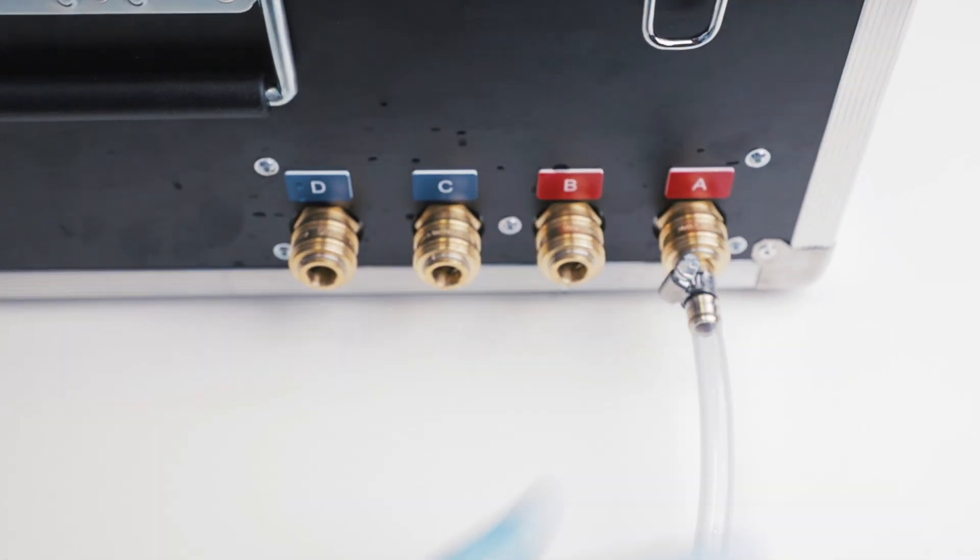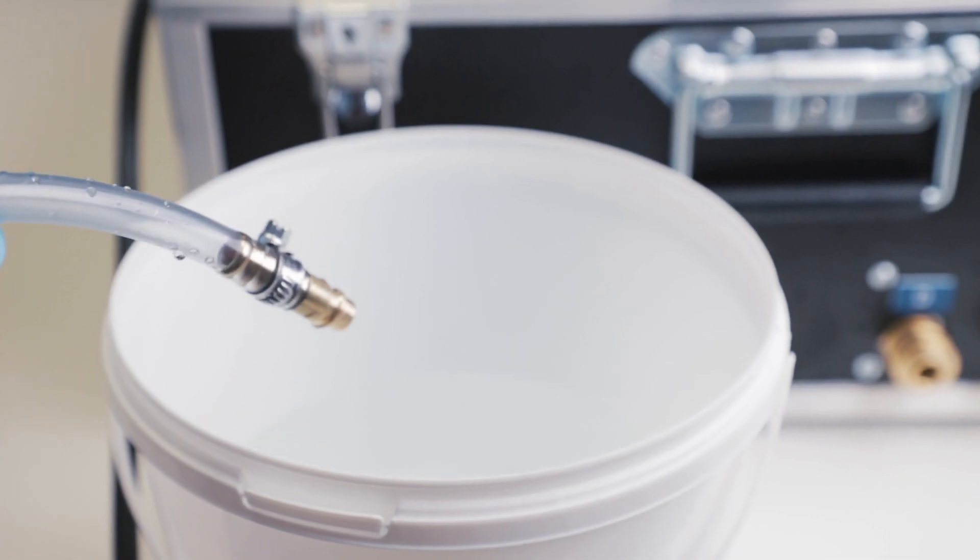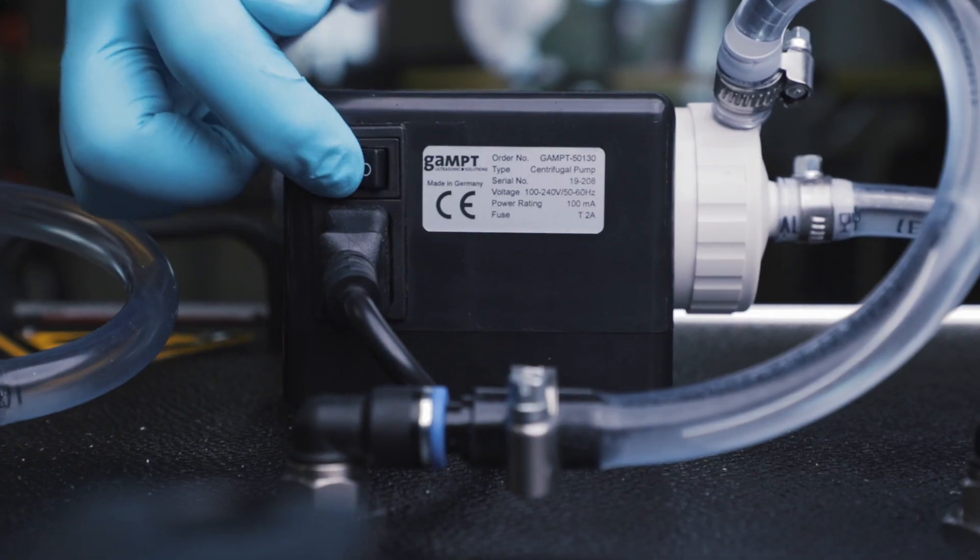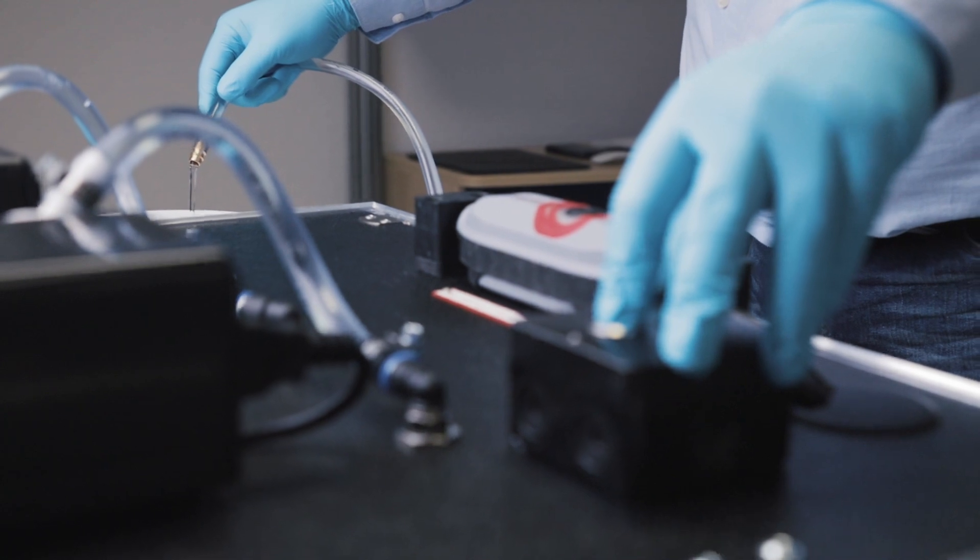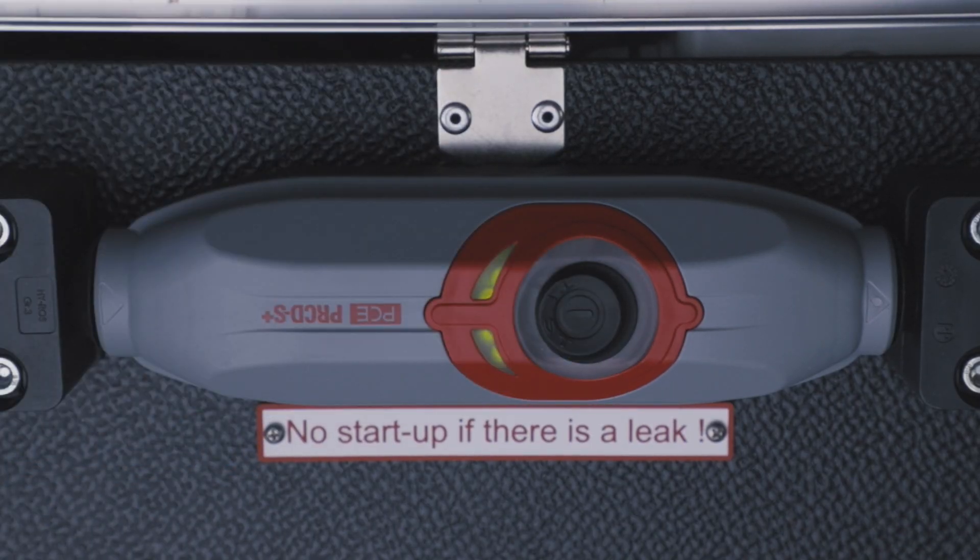Connect one tube to outlet A of the pump case. Put the other end in a bucket. Switch on power and press the filling pump button to empty the tank completely. After the training, you should switch off the security switch.